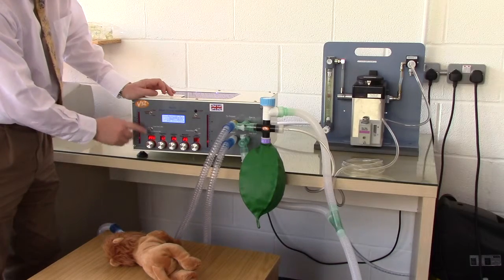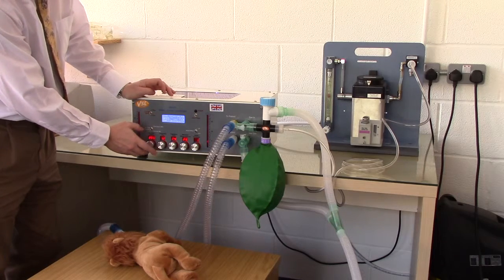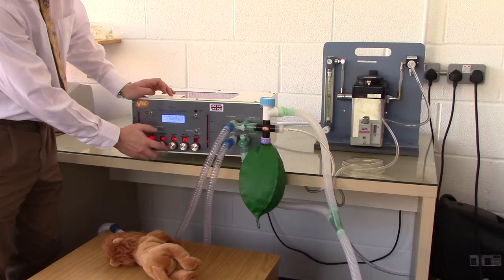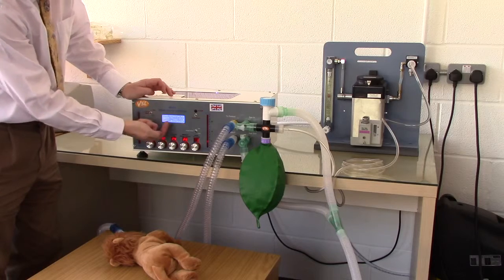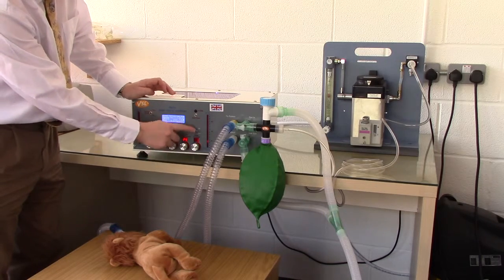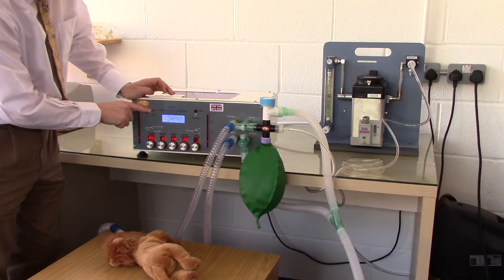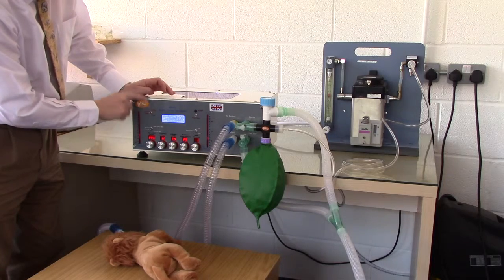So we set our tidal volume to 200mL, and our flow volume is switched to volume. Our inspiratory time to 1.2 seconds, our expiratory time to 2.4 seconds, giving us an IE ratio on the screen of 1 to 2. Our maximum working pressure limit to 25, and the assist mode off. And now set the ventilator mode to run.